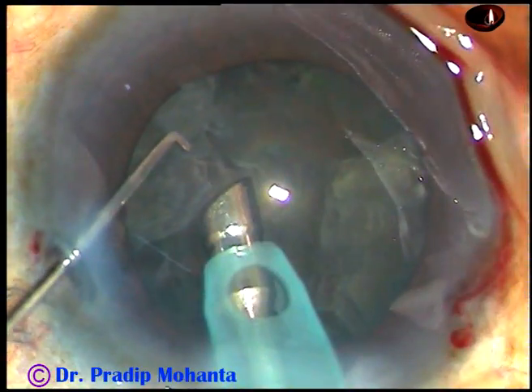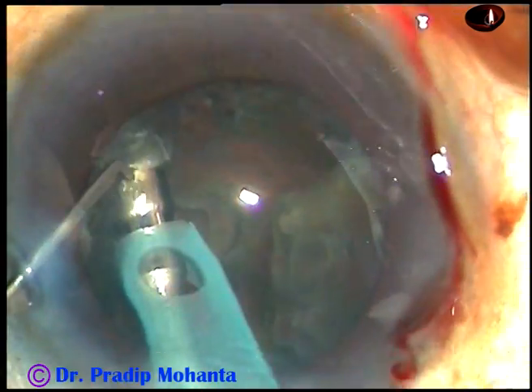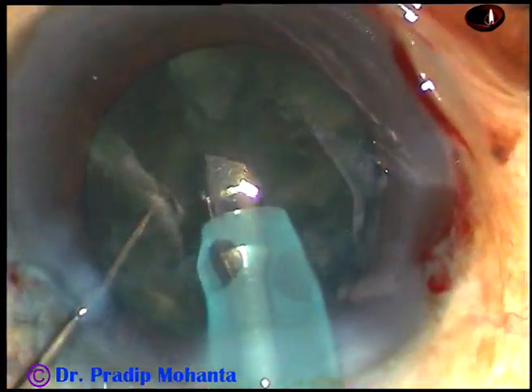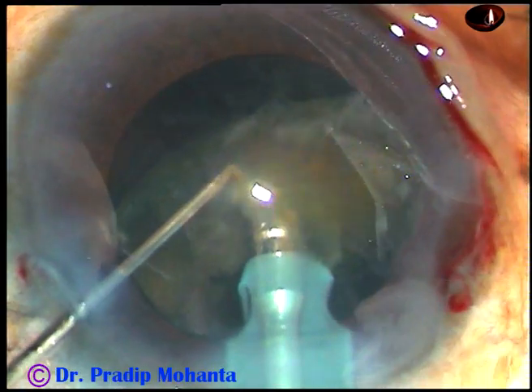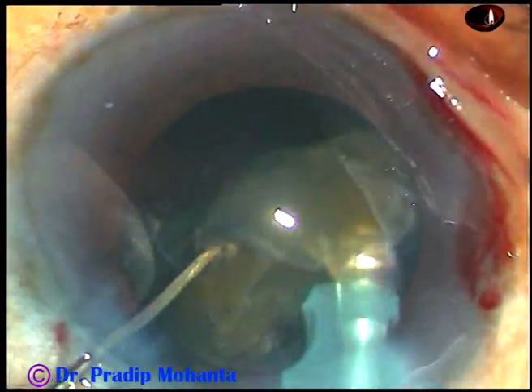And now, I try to hold it here but I find it dangerous because I am going too peripherally. So, I come to this part here and always see the bevel of the tip — it faces the nuclear mass so that followability increases.